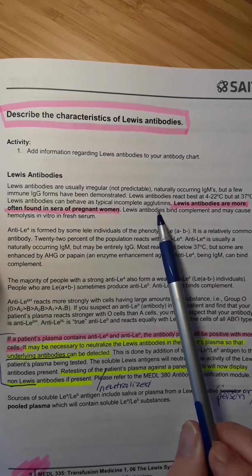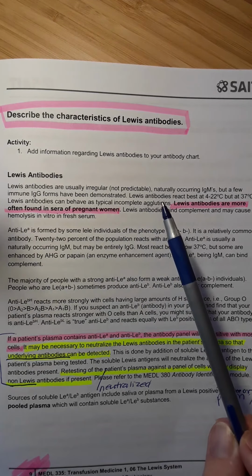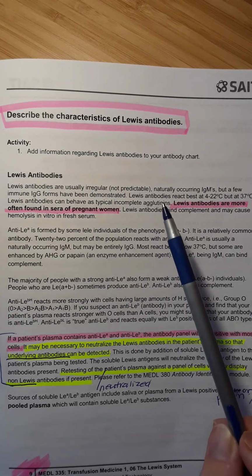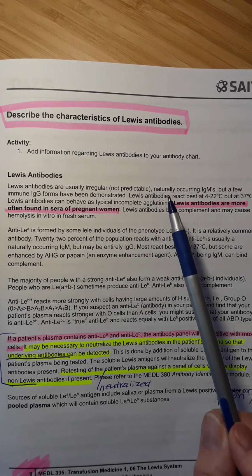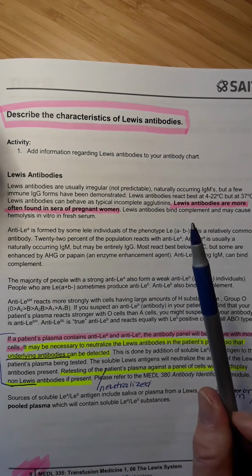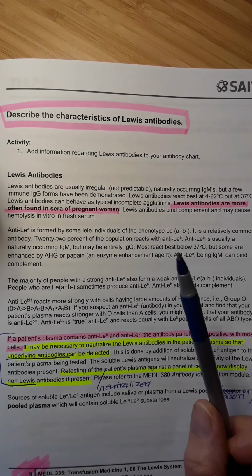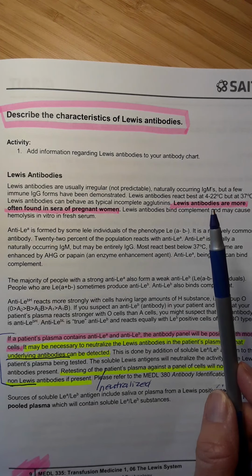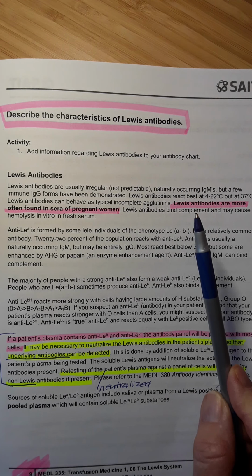And the Lewis antigens that have glommed onto the cells tend to fall back off into this excess amount of fluid that pregnant women tend to have. And so these women tend to form Lewis antibodies. And sure enough, they come in to have their baby, their antibody screen comes up positive, and then we're doing a panel to see what antibodies are present in their plasma.